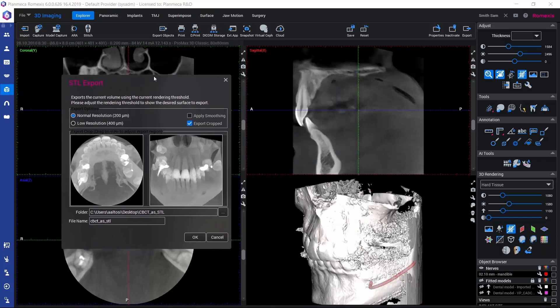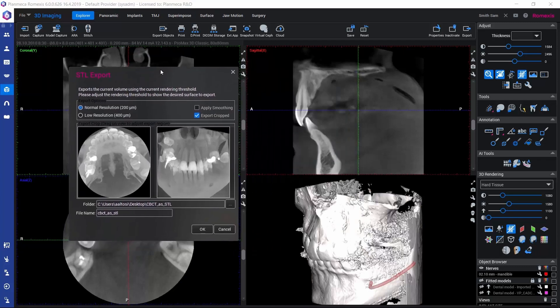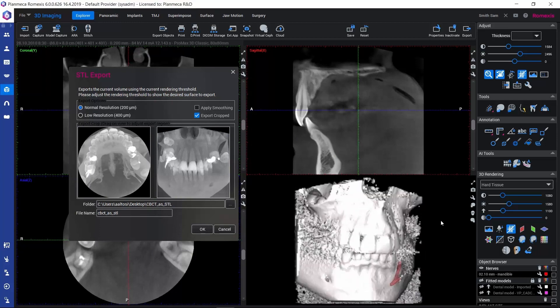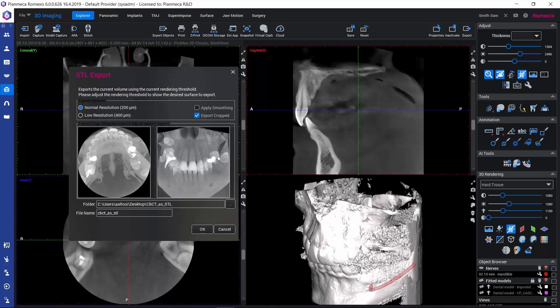Now we get this small dialog here on the screen, and the look of our 3D rendering changed a little bit. What we see here is actually the surface that we would be exporting, and we can adjust this surface by using the third slider here on the 3D rendering tools.